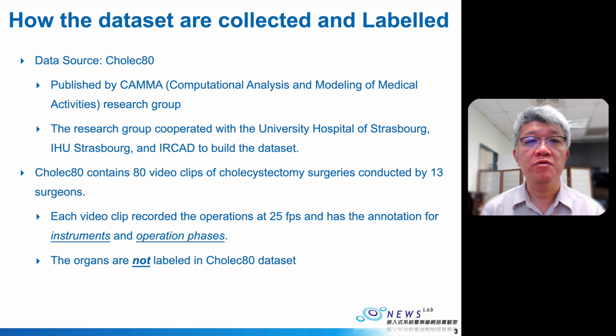Each video clip records the operation at 25 frames per second and has annotations for instruments and operation phases. Unfortunately, the human organs in these 80 video clips are not labeled in the dataset.